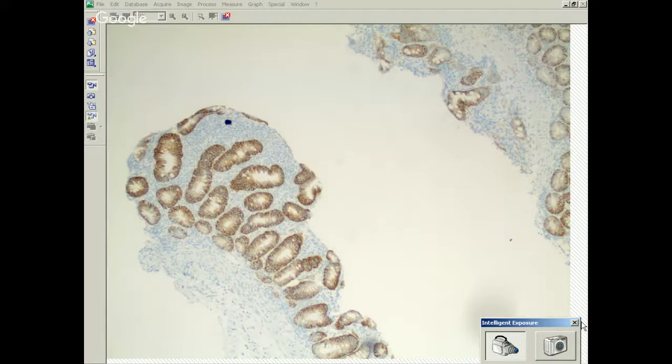Okay? Now, clinical diagnosis, so the biopsy is not necessary, but this is something that they rely on us for. Usually the patients come in with diarrhea, and they're kind of young adults. So sometimes they have no idea that the patient has CVID. And so what we see can really make that diagnosis for them, and we might need to suggest that they work up the patient. But it is a clinical diagnosis.